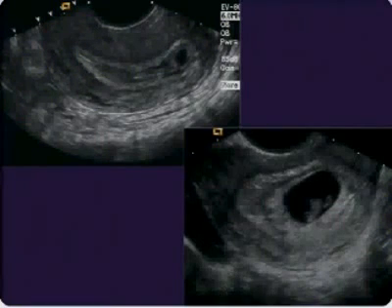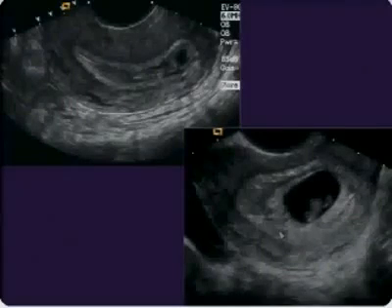And here's a beautiful example of a normal pregnancy going from a lovely intradecidual sign, notice that it's eccentric to the cavity, which is right here, to a great double decidual sign, with our inner sac being the gestational sac, the outer sac being the endometrial cavity itself, or endometrium, and this little line here, the hypoechoic line, that's actually the remaining endometrial cavity.